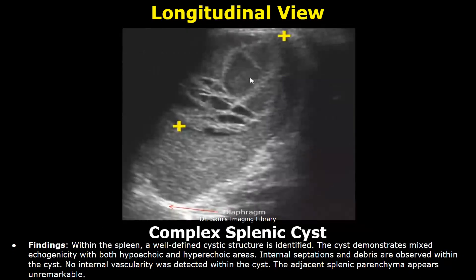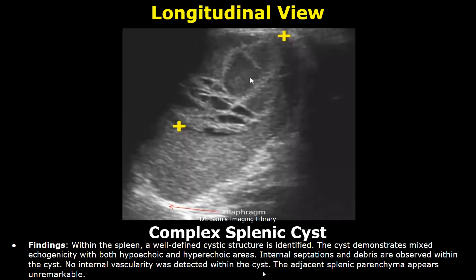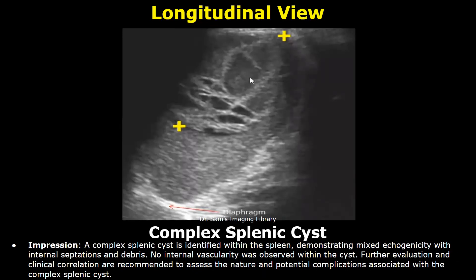Here is a case of complex splenic cyst. The cyst demonstrates mixed echogenicity with both hypoechoic and hyperechoic areas. Internal septations and debris are observed within the cyst. No internal vascularity was detected. In the impression, a complex splenic cyst is identified within the spleen, demonstrating mixed echogenicity with internal septations and debris, no internal vascularity, and it ends with the line of clinical correlation.